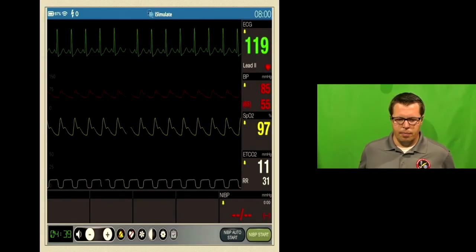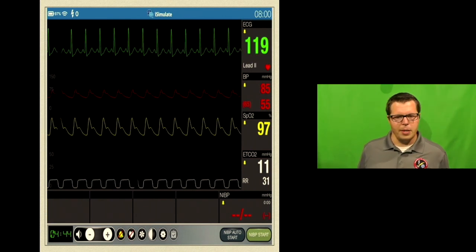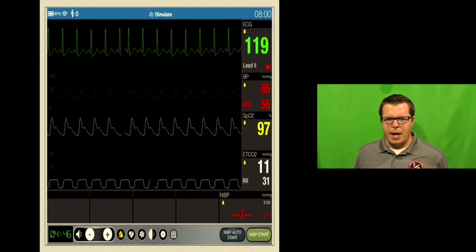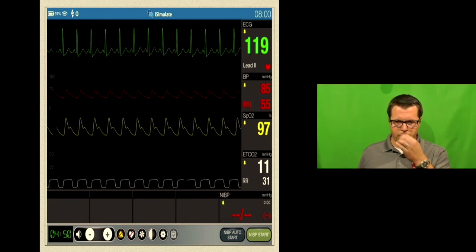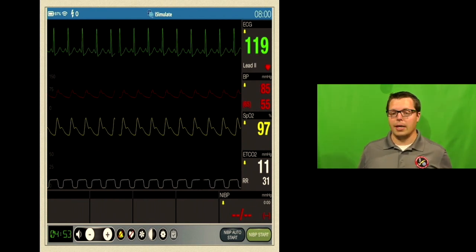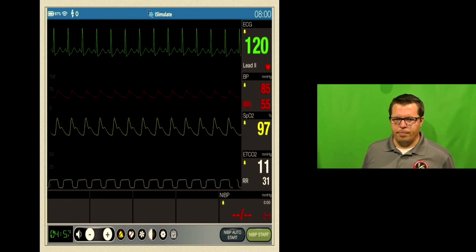So let's say that you have this. We've intubated a patient for whatever reason. He's a trauma patient, let's say. Got the tube, have a good waveform down at the bottom. The tube is definitely in the right spot. He's breathing about 30 times a minute spontaneously, we'll say the sux has worn off. And we find an end-tidal CO2 of 11.